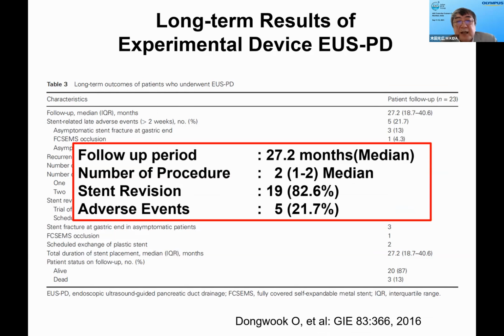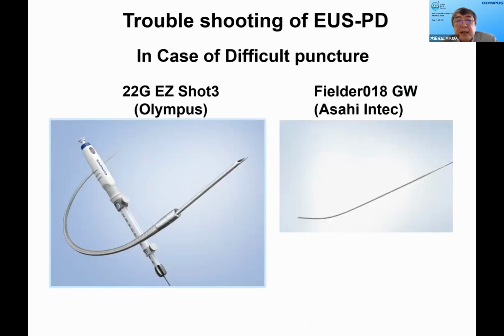I believe this experimental metallic stent is still under investigation. We have to improve the metallic stent in the future. And troubleshooting of the EUS-PD.